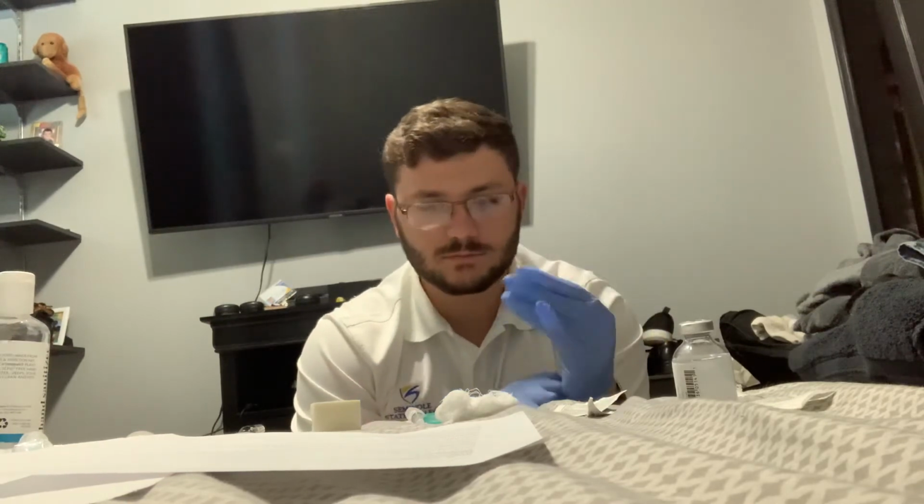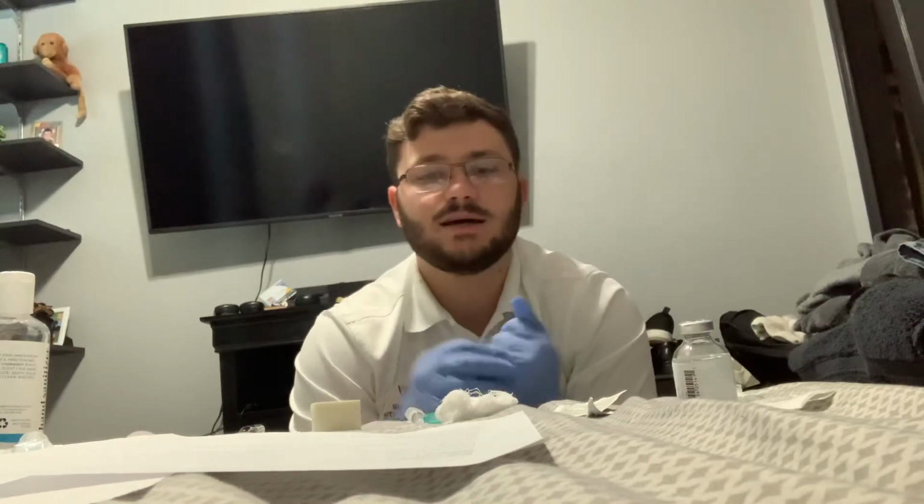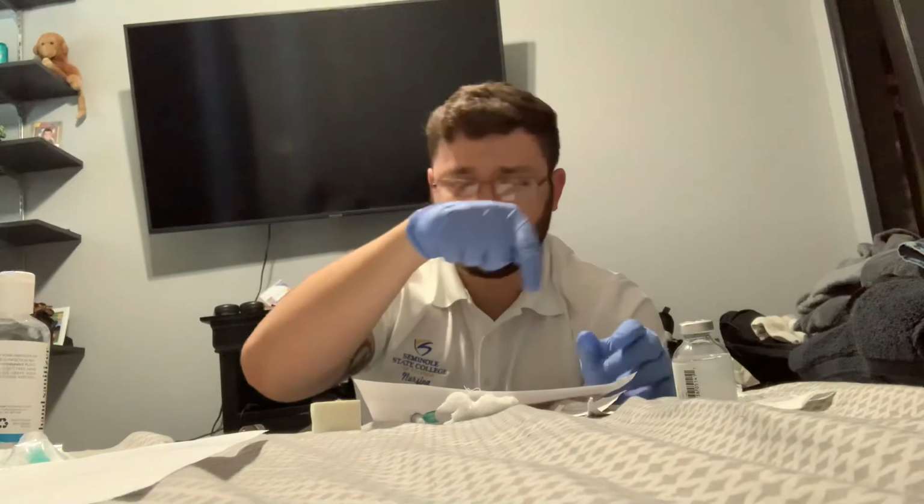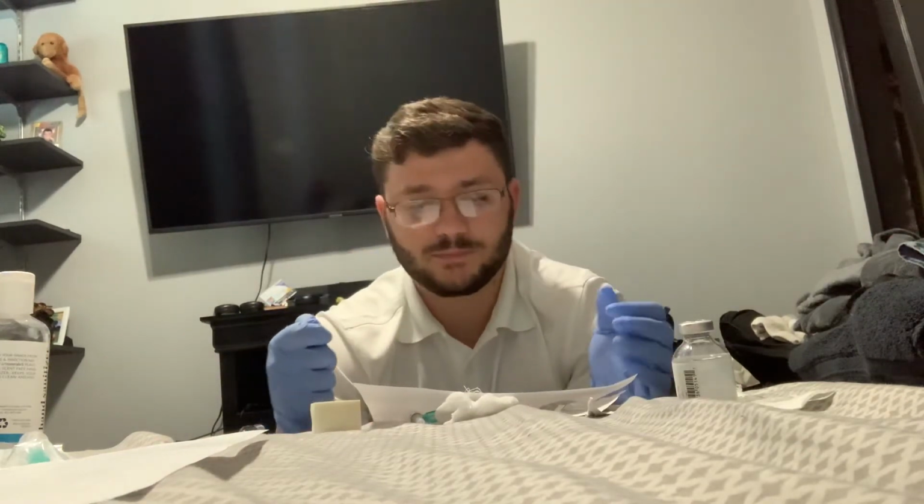All right, so we're going to be doing our final check at the bedside. So I have Anna Pawlowski for the medication, influenza vaccine, 0.5 mLs via IM, start date 5/11/2020 at 14:58, and in this case we would begin by scanning the medication, and then scanning the medication chart, or scanning the band, and it'll pop up on the chart, and we're going to tell them or state that we are going to be beginning.